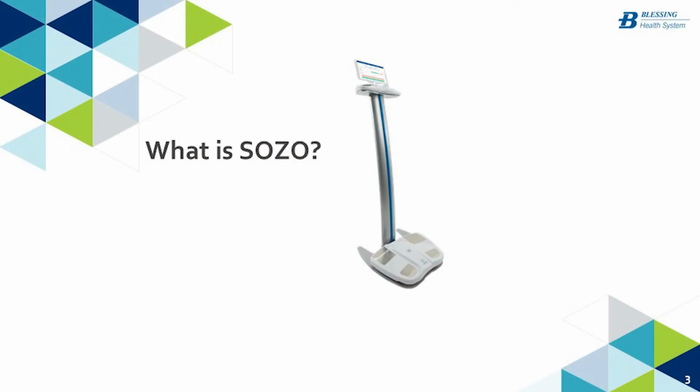Now, the Blessing Breast Center is introducing this new testing technology, as we alluded to earlier, and it can help diagnose lymphedema. Can you tell us about this new testing device? Yes. So the piece of equipment is called SOZO, and it looks just like a standing scale. Patients will come in, remove their shoes and socks, stand on the equipment, place their hands on a platform, and it takes about 30 seconds. And the equipment measures the fluid volume in the limb that we identify to the equipment.